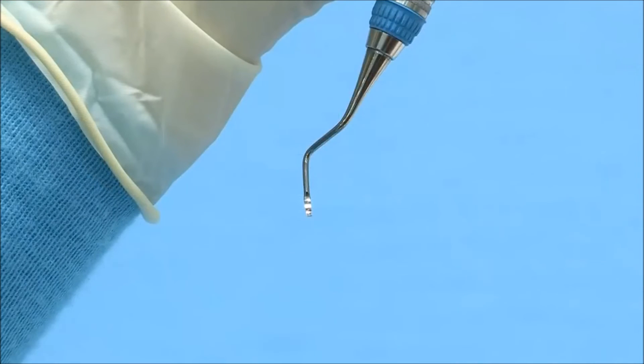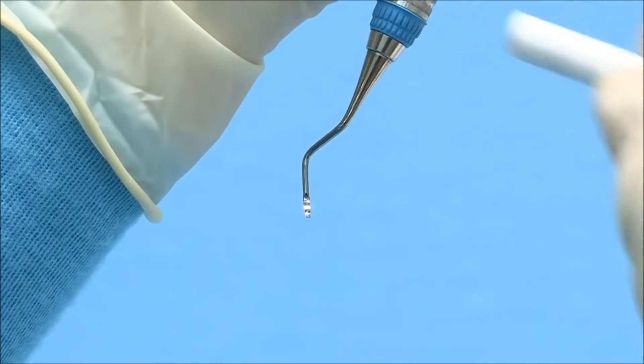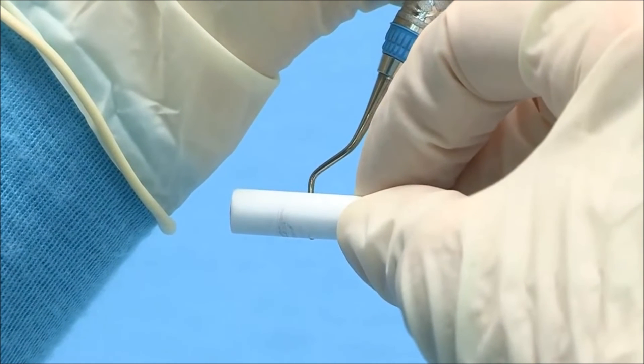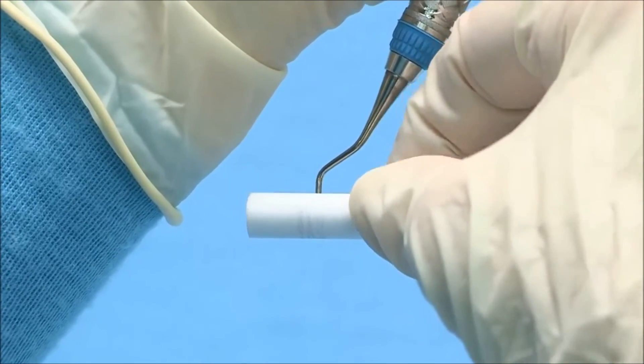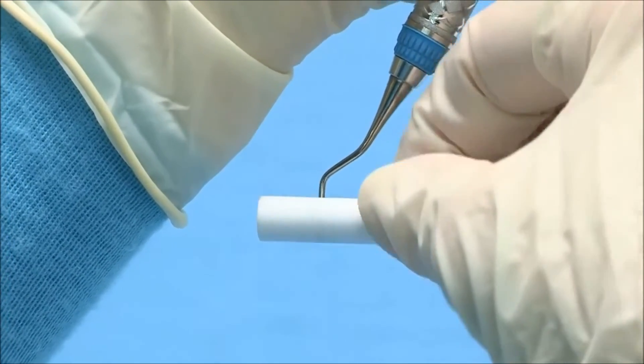To finish sharpening a universal curette, hold the blade at eye level with the terminal shank at 12 o'clock with the toe pointed towards you. Position the cylindrical stone along the face of the instrument at 3 and 9 o'clock. With slight downward pressure, roll the stone along the face from the heel to toe, removing any wire edges.